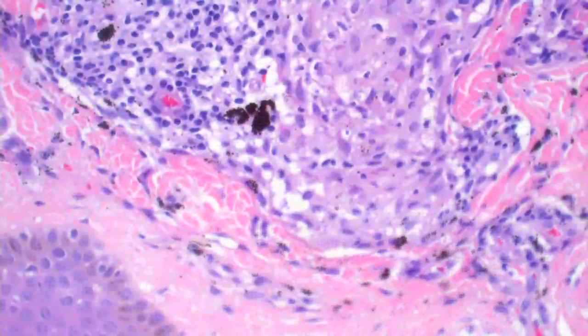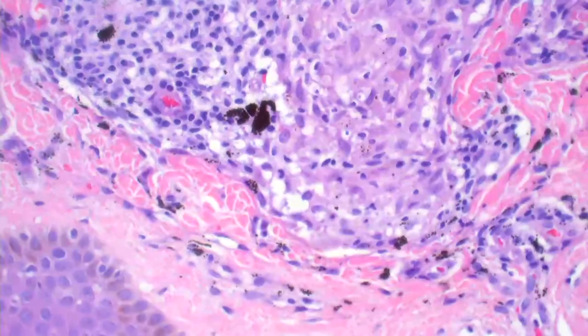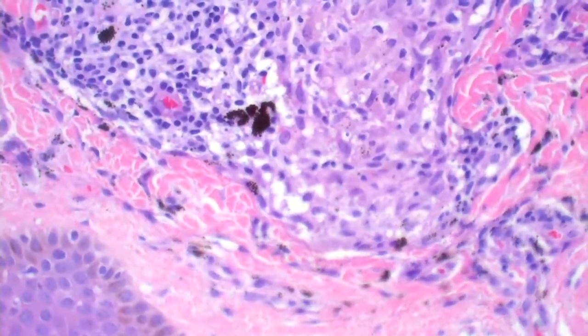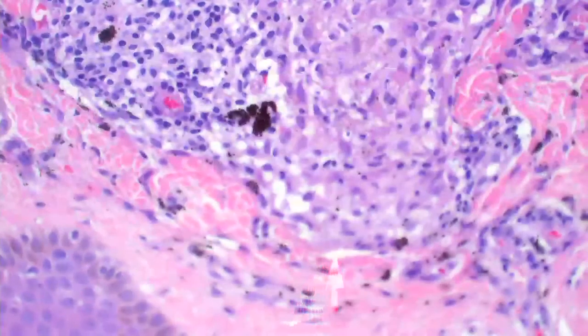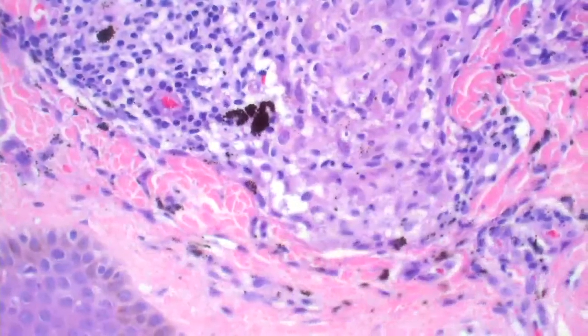Do you know what the material is? Well, carbon tattoo or just a black tattoo, really. Yeah, some of this sure looks a lot like carbon, although it's also got these little tiny droplets in a way, so this may be a dark carbon-containing ink rather than just a carbon tattoo from a pencil lead.